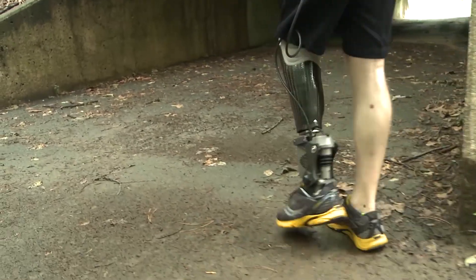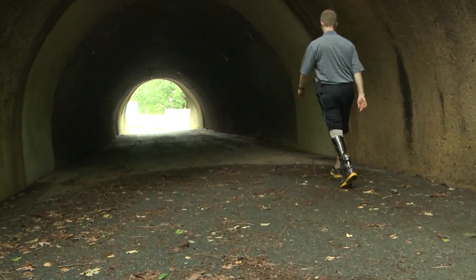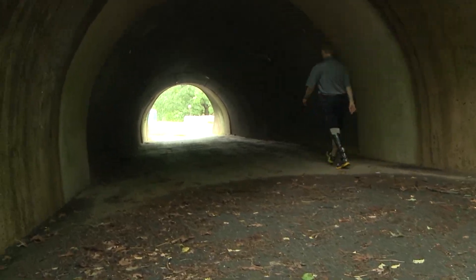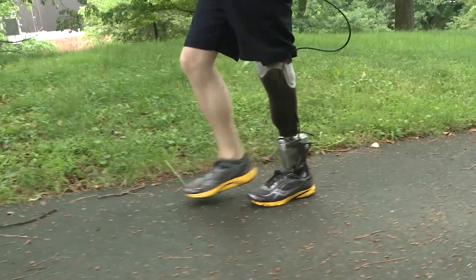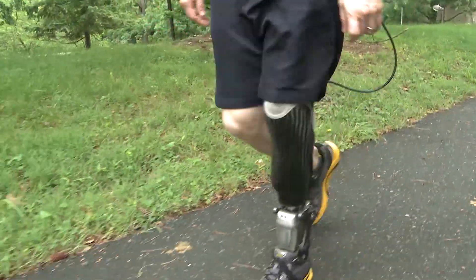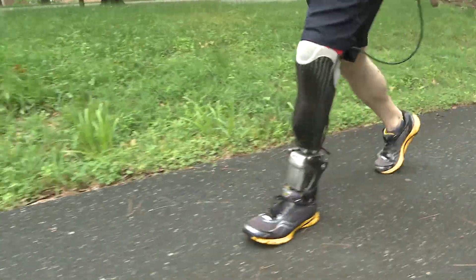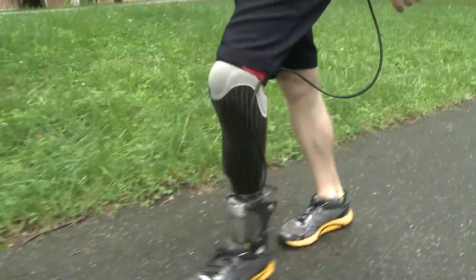On the commercialization side, Spring Active has formed a relationship with Usir to commercialize a civilian version of this technology, primarily designed to support walking gait. A lot of the technology developed here and the things we're learning are going into that civilian commercialization effort.